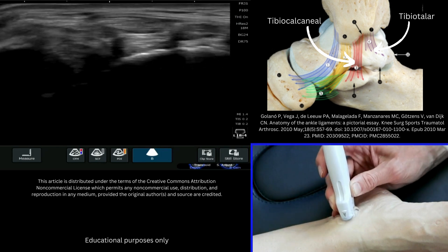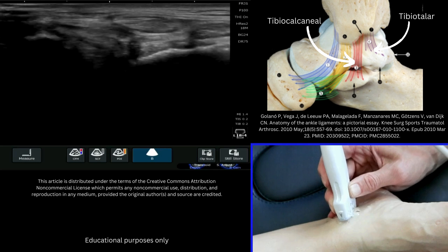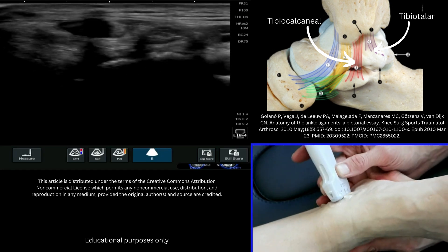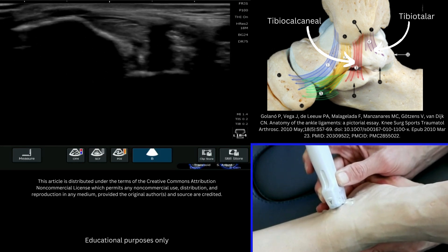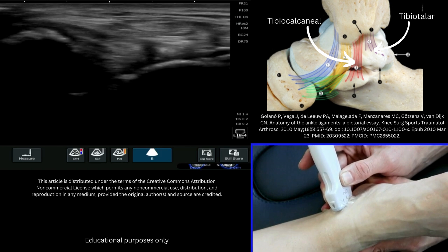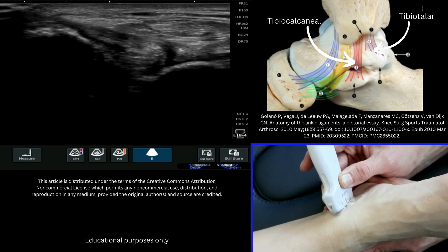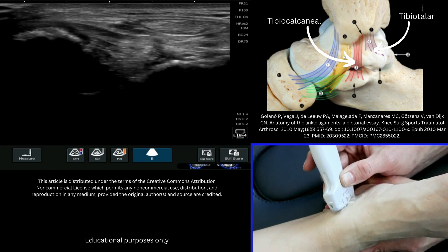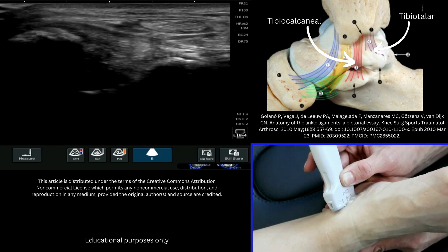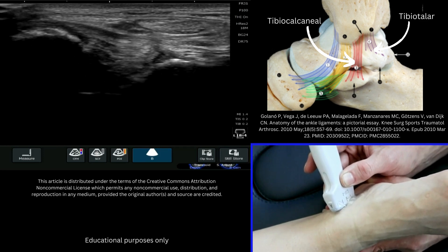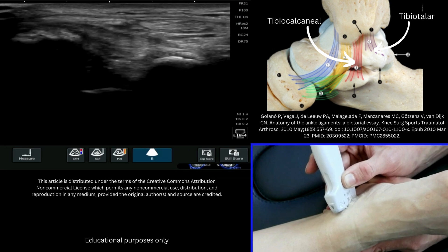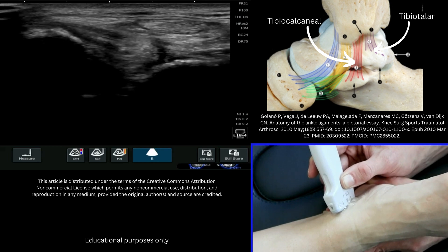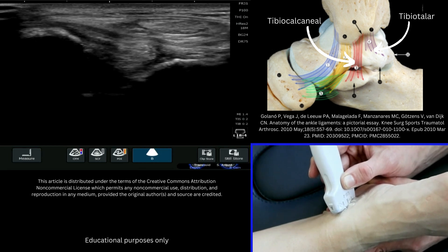We're going to roll the probe down a bit more inferior, and at that point I'm going to hold the patient's heel so that I can place an eversion stress on it. We can then roll our probe around, keeping that malleolus on the left of the image nice and clear, and I'm going to place an eversion stress. That will help open up that deep recess on the medial ankle to enable me to see these deep fibers of the tibiotalar ligament — the tibiotalar component of the deltoid ligament.